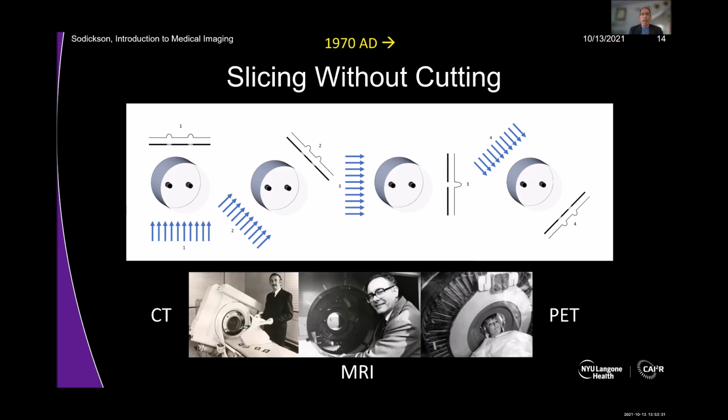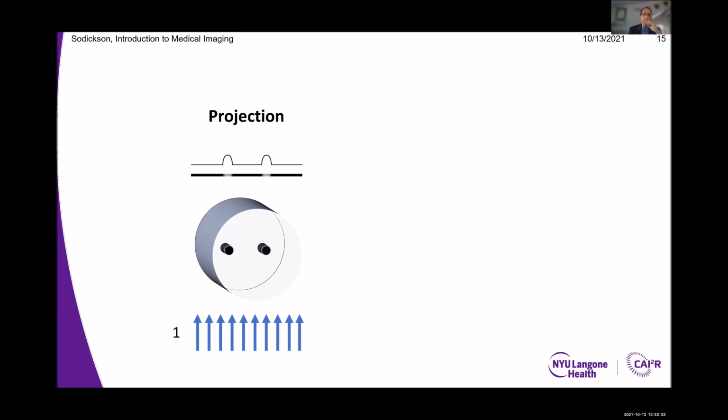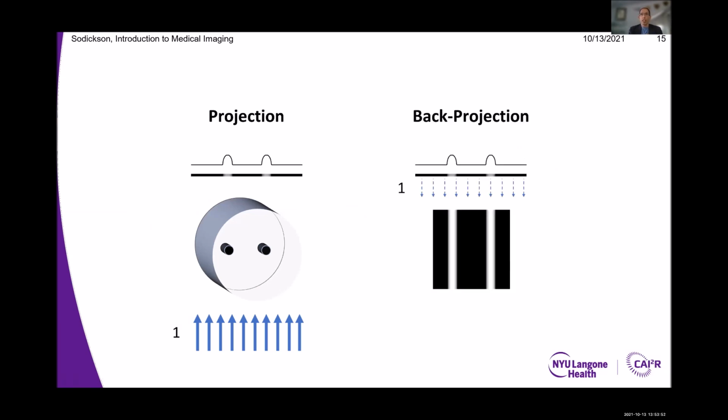So how do we do this sorting out? How do we undo that summation transform? Well, here's a sort of intuitive algorithm. There are many algorithms now out there, and I'll get to the inverse problems that Urvashi just discussed in a little bit. But just to give you an intuitive sense first, here's a way. Let's say you have a projection going through this schematic object in this direction. What you can do is take that projection and smear the intensities back along the direction the projection came.